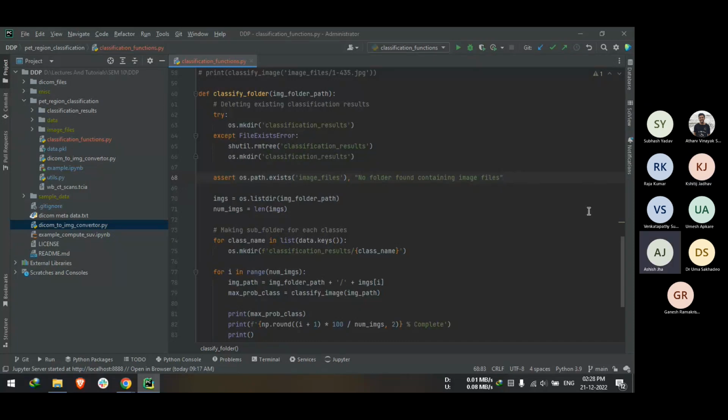So I saw the image and I think it's working very well. I think it's a nice approach to first segregate the image into various parts, and then identify the organ in that area, and then any abnormality. Yeah, so that is exactly the plan. Now that we have segregated it into 4 groups, we will try to identify the organs within each group, and then overlap it with the PET SUVmax data to identify which specific organ it is. That is the workflow for the next few weeks.